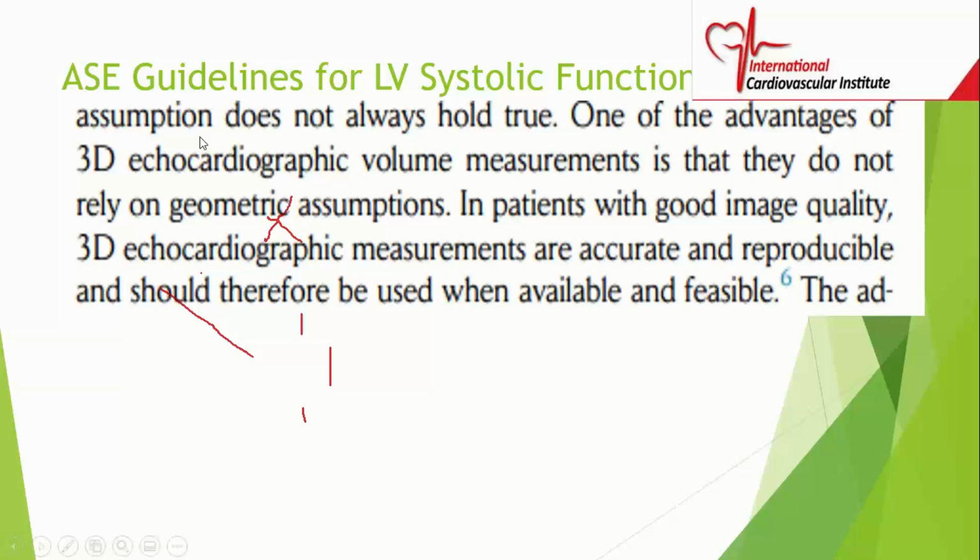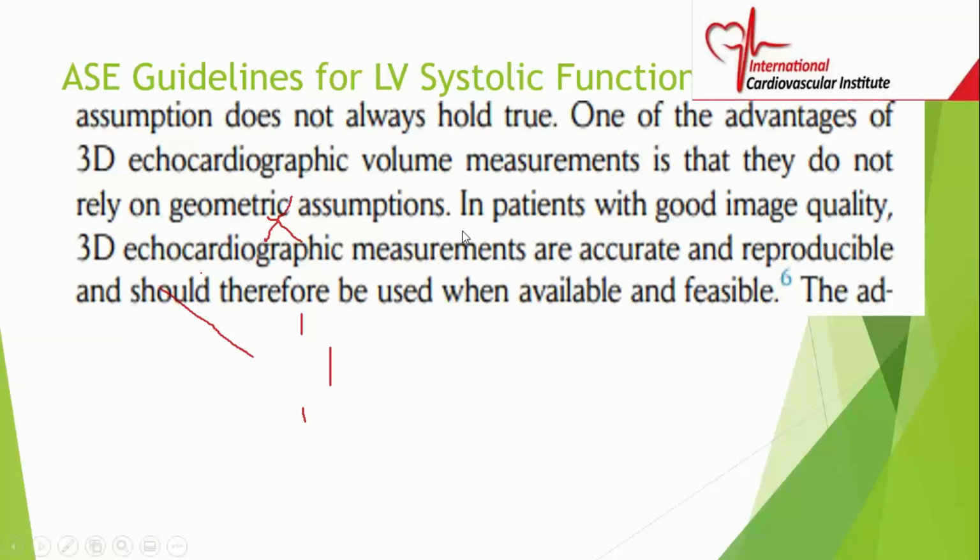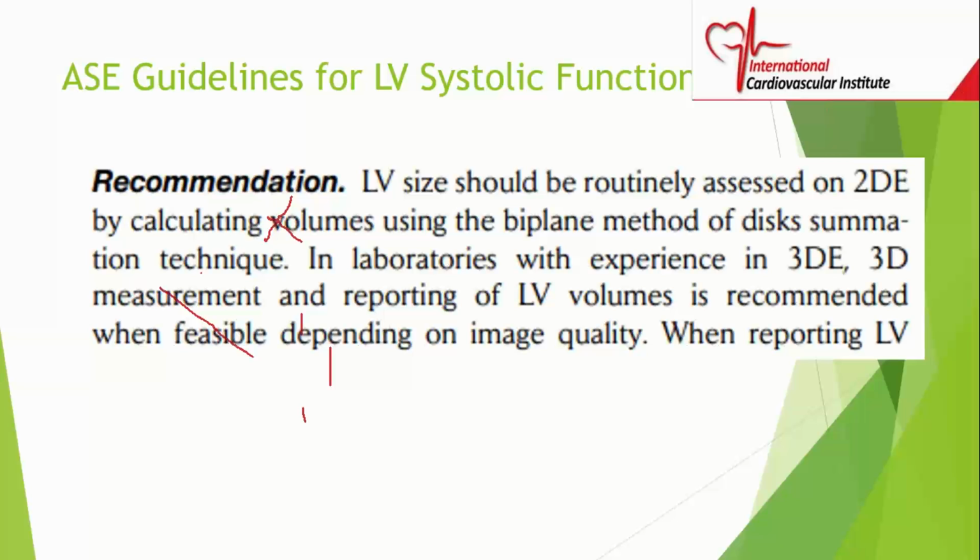One of the advantages of three-dimensional echo volume measurement is that it does not rely on geometric assumptions. If there's any question that has to do with volume and they have three-dimensional echo, that is the right answer. Three-dimensional echo gives you superior volume analysis.